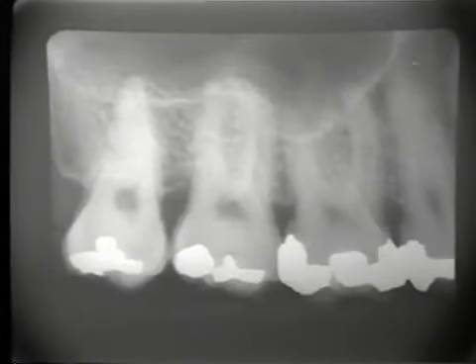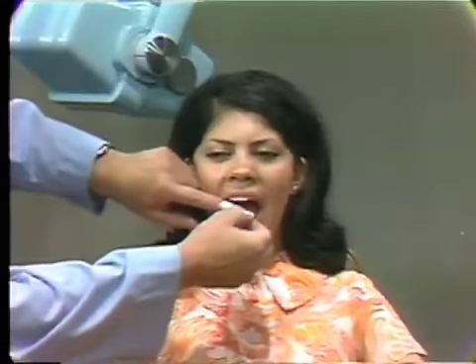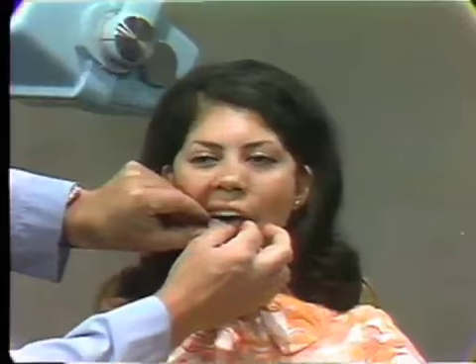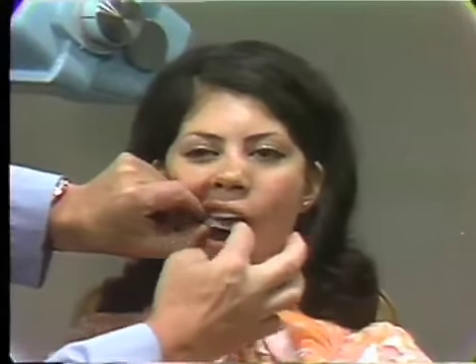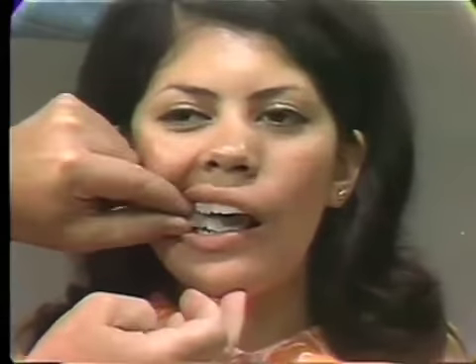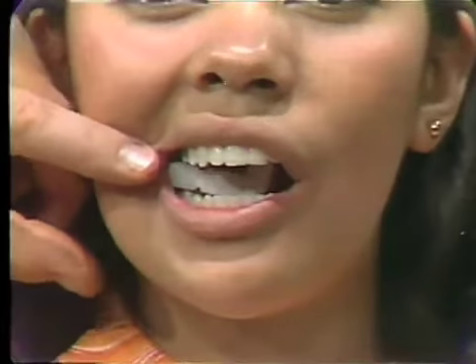Now we'll insert the film in the patient's mouth in the same manner as we did before. Now gently close, please. Now you notice the film is some distance away from the teeth.